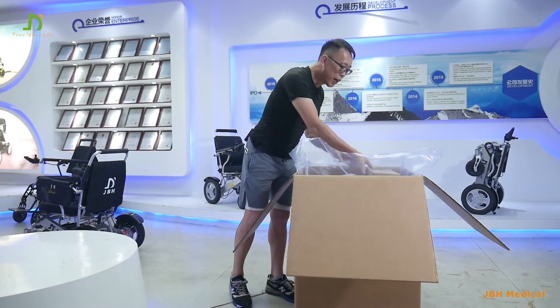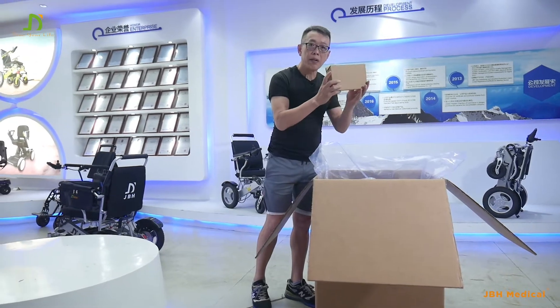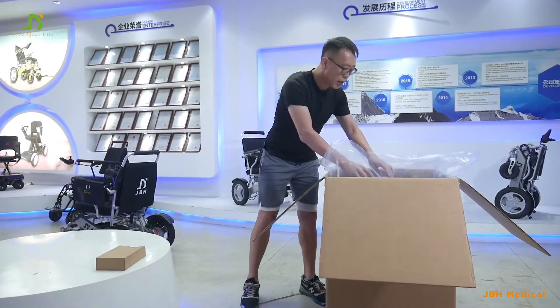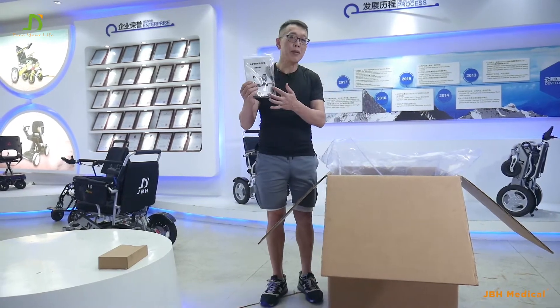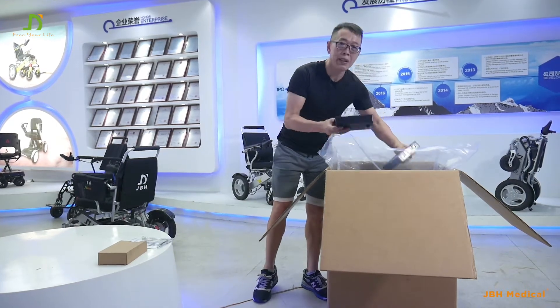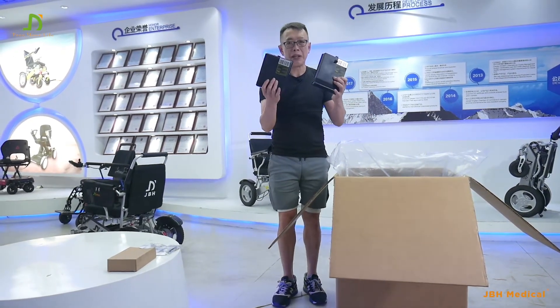Next, we take out the box of the charger here, along with some simple tools and some cable. Two batteries — this is really important — two batteries.